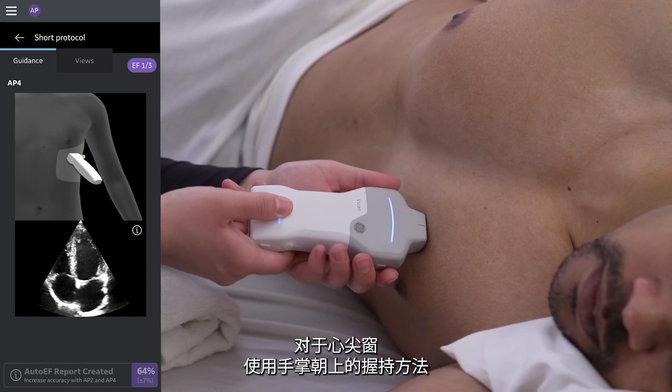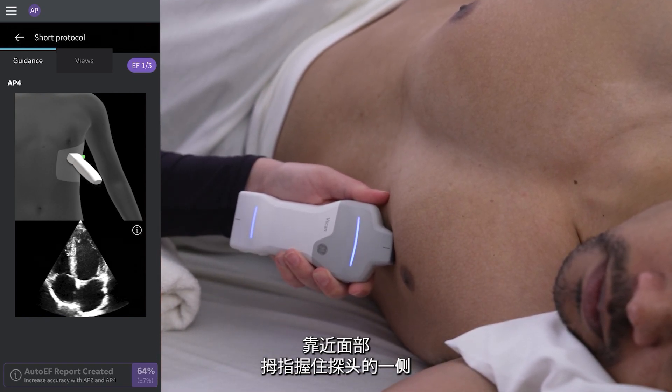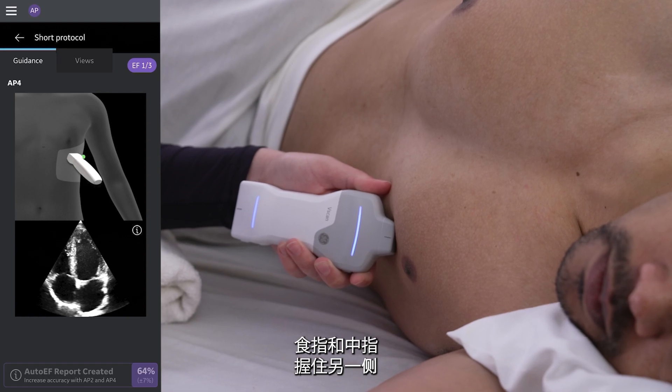For the apical window, use a palm-up grip. Grip the probe close to the face with your thumb on one side and pointer and middle fingers on the other.